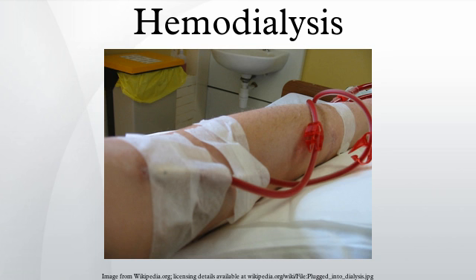Aside from infection, venous stenosis is another serious problem with catheter access. The catheter is a foreign body in the vein and often provokes an inflammatory reaction in the vein wall. This results in scarring and narrowing of the vein, often to the point of occlusion. This can cause problems with severe venous congestion in the area drained by the vein and may also render the vein, and the veins drained by it, useless for creating a fistula or graft at a later date. Patients on long-term hemodialysis can literally run out of access, so this can be a fatal problem.